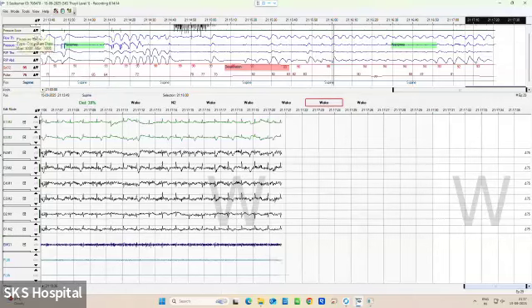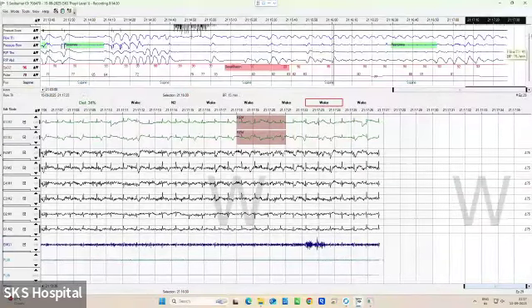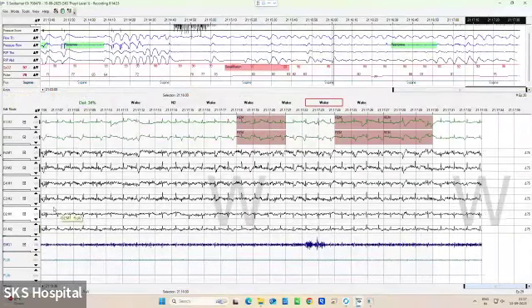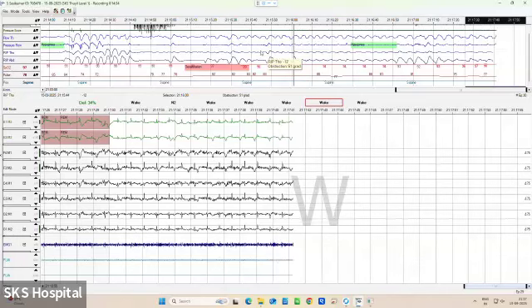So this is a dual-pane window, where this one is an EEG window and simultaneous recordings of respiratory channels can be kept here. This is a 4-minute window, and this is a 30-second window. EEG should be scored in a 30-second window, whereas respiratory channels can be scored between 2 minutes to 5 minutes. Any time window can be chosen as preferred by the therapist.